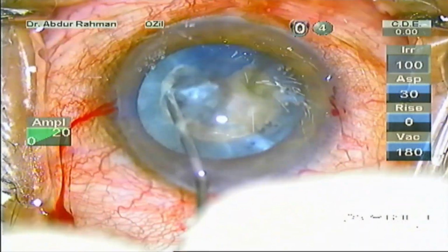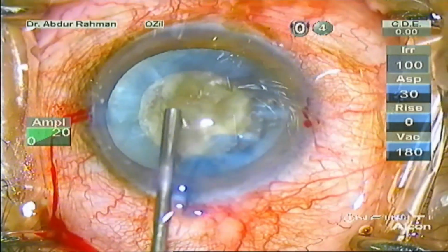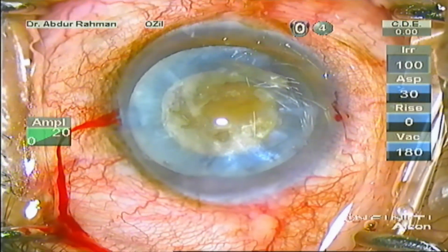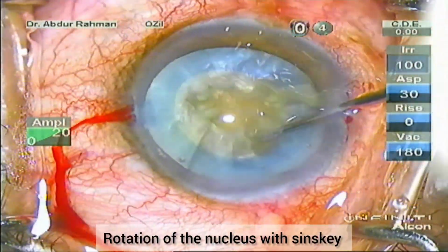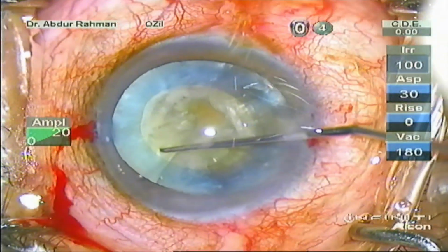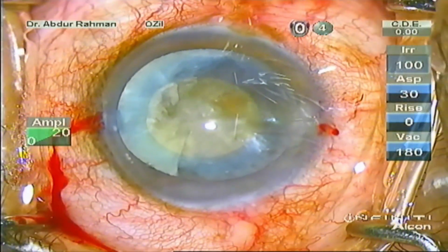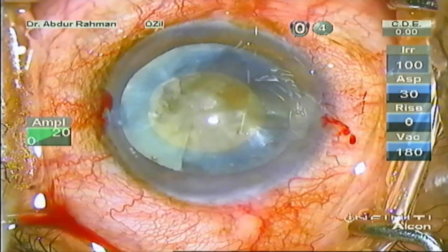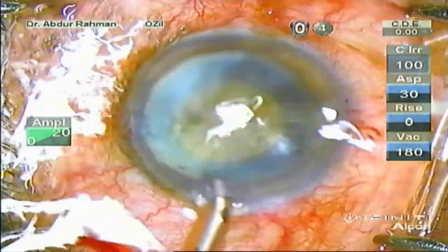Now wash out the flap with BSS and perform hydrodissection and hydrodelineation if possible. But here hydrodelineation is not possible. So I only performed hydrodissection and now I'm rotating the nucleus. Hydrodissection was also not necessary because most of the cortex was liquefied and was soft in nature.